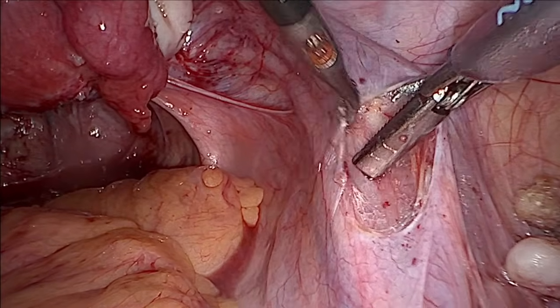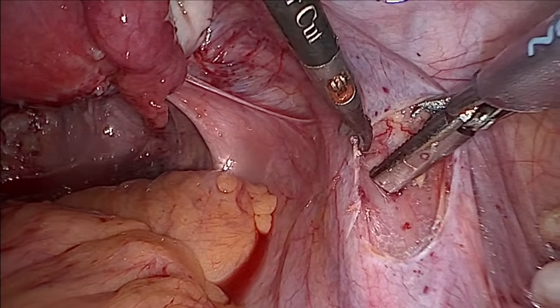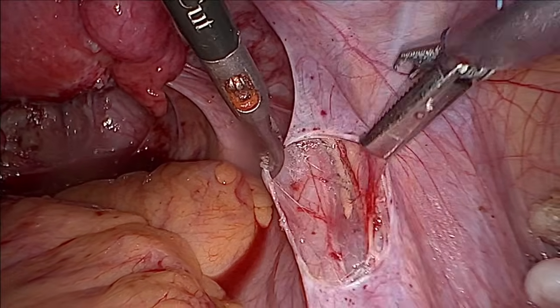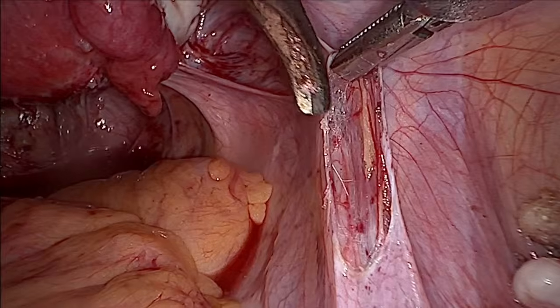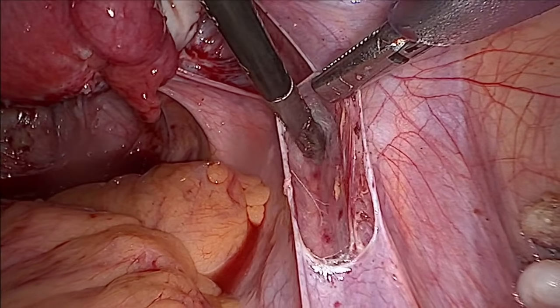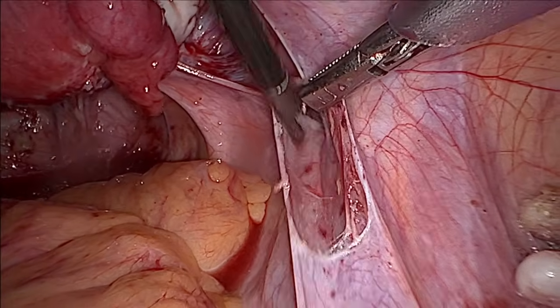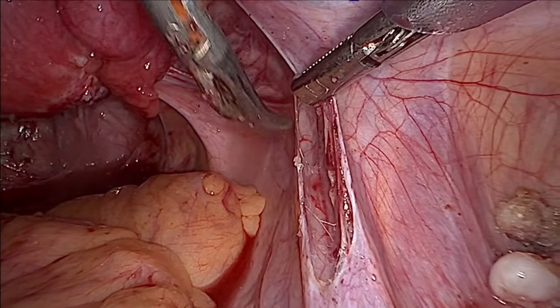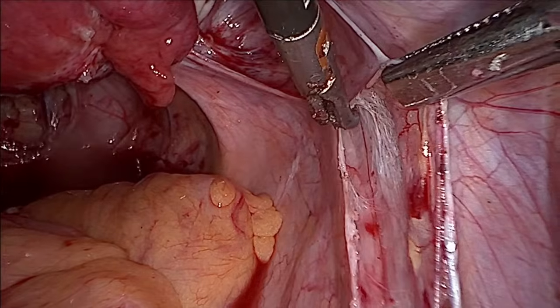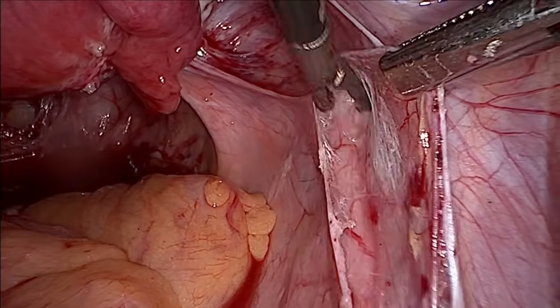Open up your instrument and you can see I am following the path of the ureter here. Again the same technique which we followed for the left. Go to the ureter, stay above it. Okay, dissect anteriorly, create a plane. Okay, and go on cutting the peritoneum.